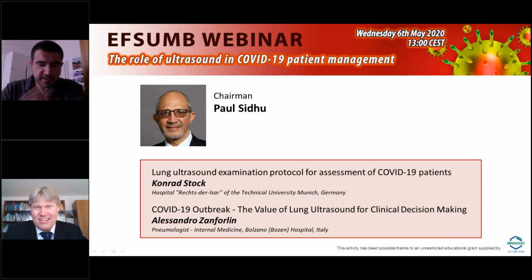I think that out of the detection capability of the ultrasound, you cannot diagnose microthrombosis from the surface. I think it is quite impossible. You can see consolidations, but you cannot make a histologic exam with ultrasound. Also from the kidney septum or from the liver septum, I think due to the air artifact, you cannot really see whether it is a vascularization or not in the micromillimeter range. But you're completely right, we have to have a histologic correlation between that.